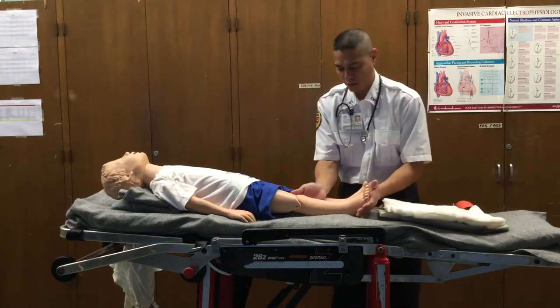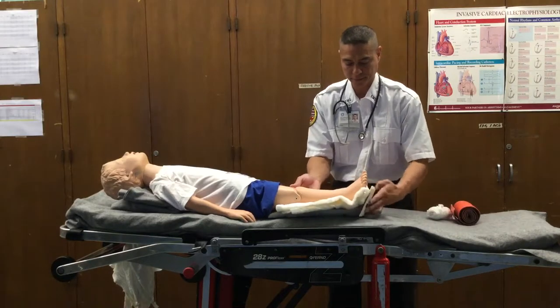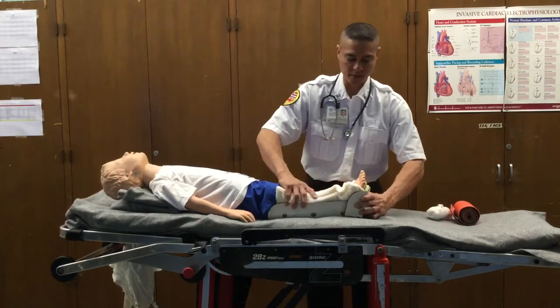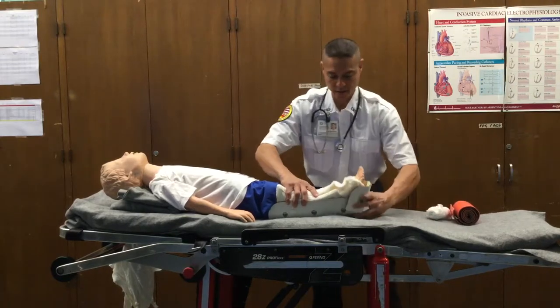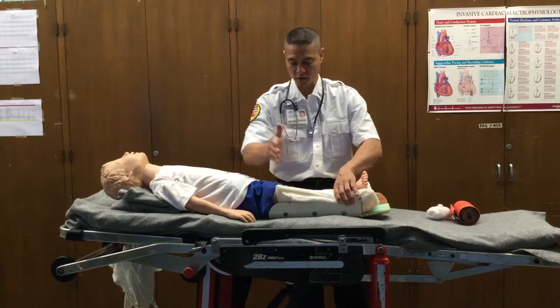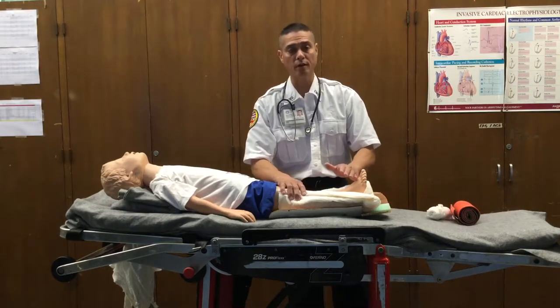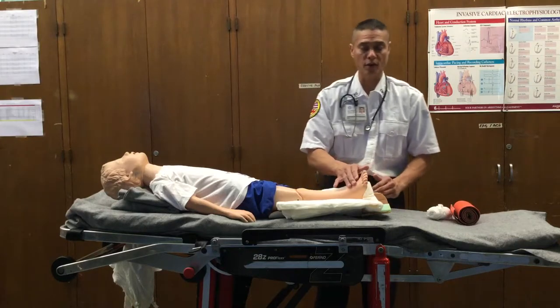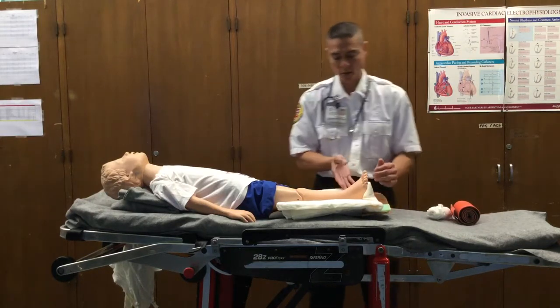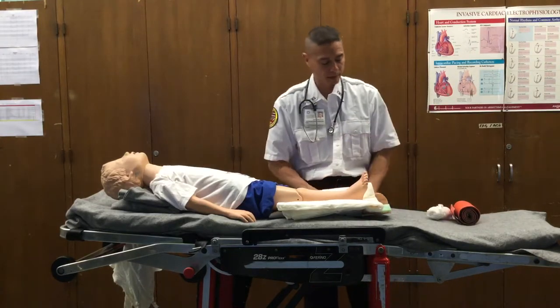We're going to have our second rescuer help us gently elevate the leg as we slide our splint underneath. We're going to manage and wrap this all together, making sure we secure above and below the fracture sites and the joints above and below the fracture sites, while keeping the distal area exposed to check the distal parameters — leaving the dorsalis pedis and posterior tibialis accessible so we can evaluate the pulses once we're done.